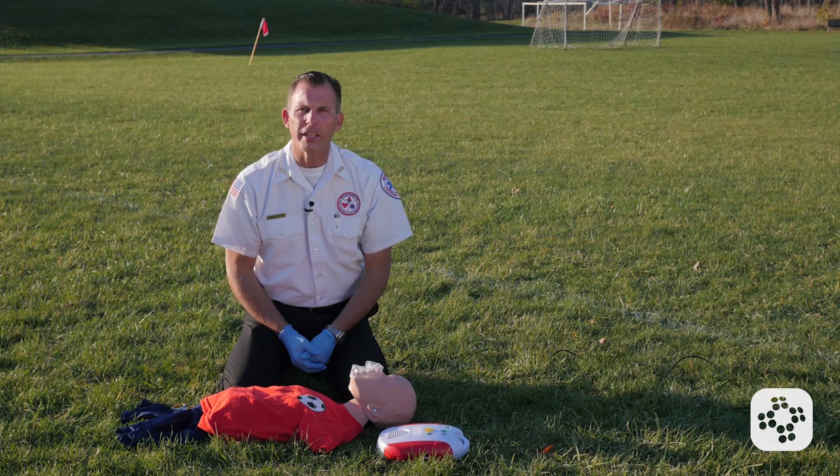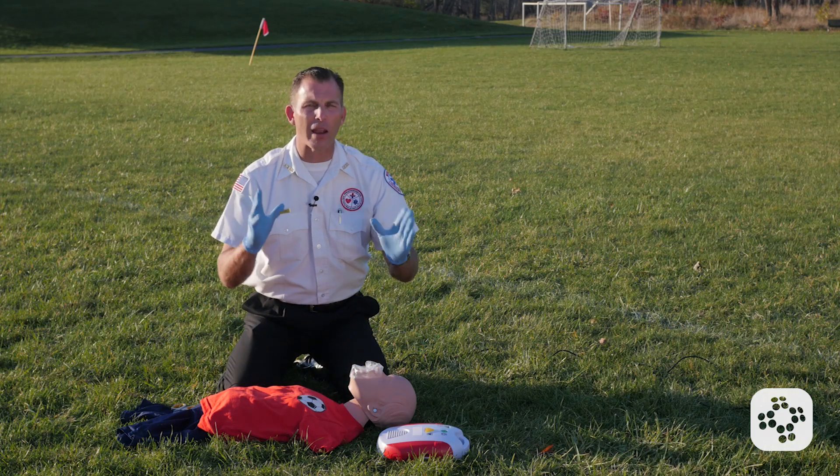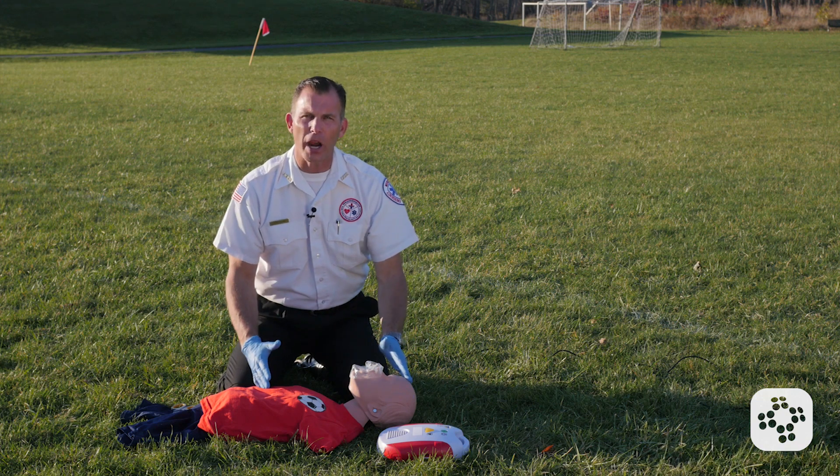Now let's cover child AED. We're going to say that this child has already been in cardiac arrest, 911 has been activated, an AED was brought to us, and CPR has been in progress.